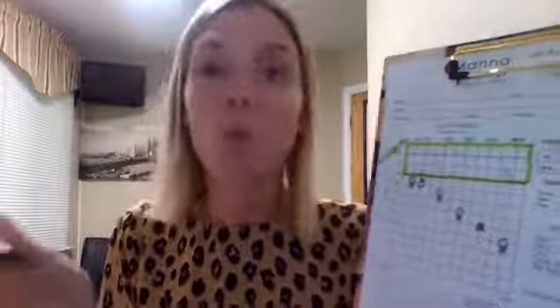So once we have this information, what are the next steps? So this is going to tell us whether or not you have a hearing loss, obviously. It's going to tell us whether or not you are a hearing aid candidate. If you are a hearing aid candidate, then we can talk about the different options available to you, the different styles and levels, and have a big old conversation about hearing aids. So hopefully this gave you guys a little bit of insight into what normal hearing looks like versus a hearing loss.